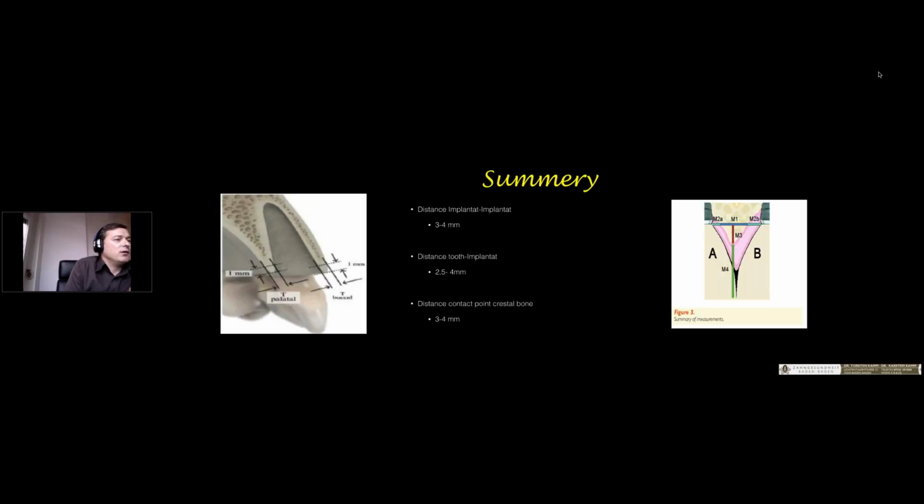Then another important thing is the distance from the contact point to the crestal bone.